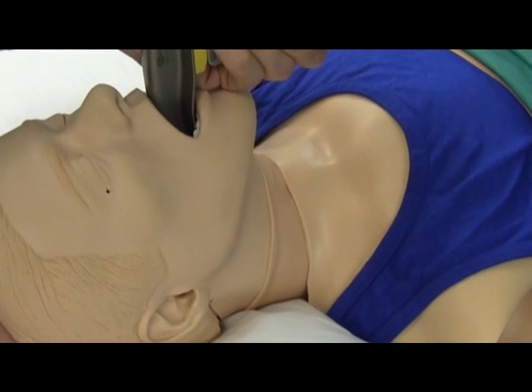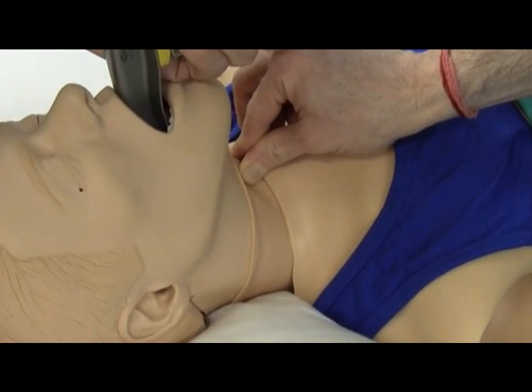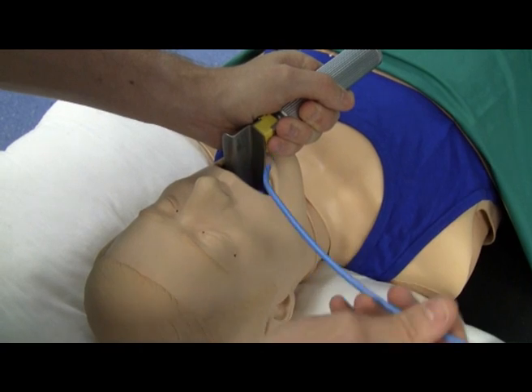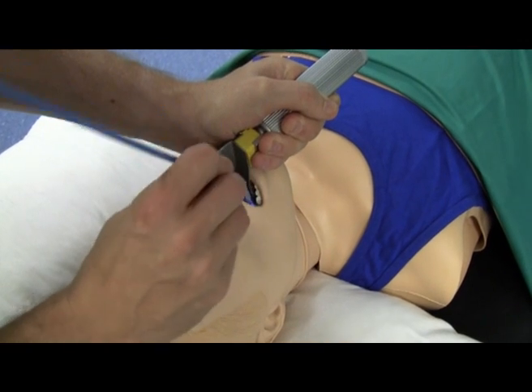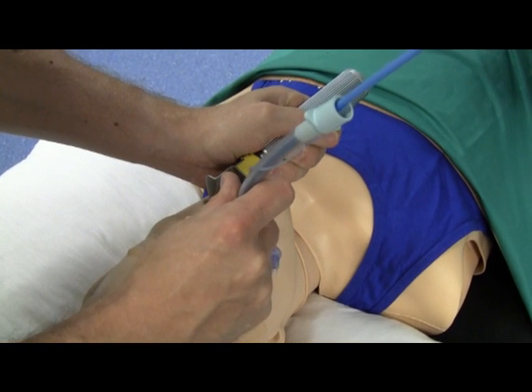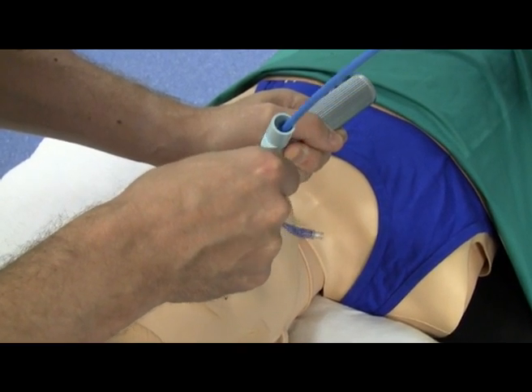Sometimes you might not be able to see the glottis. In these instances you can ask your assistant to apply some external laryngeal pressure, which will sometimes bring the glottis into view. Once you've identified the glottis, grab the bougie in your right hand, making sure that you insert the end with a bent tip first. Pass that into the mannequin's mouth, past the vocal cords and into the trachea. Ask your assistant to railroad your endotracheal tube over the bougie, making sure that you insert it beveled end first. Sometimes the tube can get stuck at the glottis — a useful trick is to rotate the tube anti-clockwise whilst you advance it.